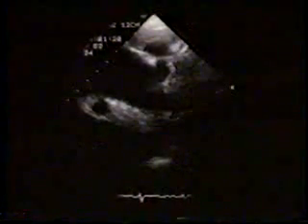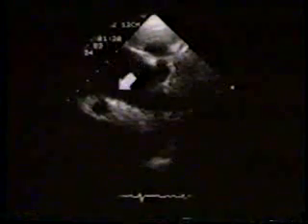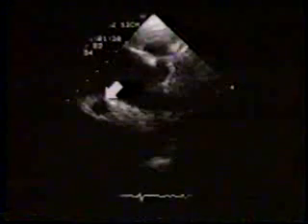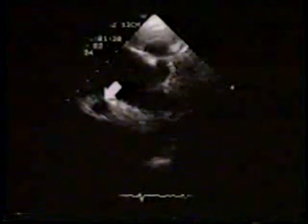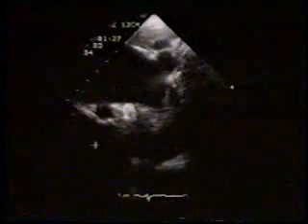In these patients, it is crucial to identify and size the pulmonary arteries. This is the suprasternal notch view demonstrating a dilated transverse arch, and here is a small right pulmonary artery. Observe this in real time now. Having identified the pulmonary artery, it is important to size this dimension. In this patient, it measured 1.1 centimeter.